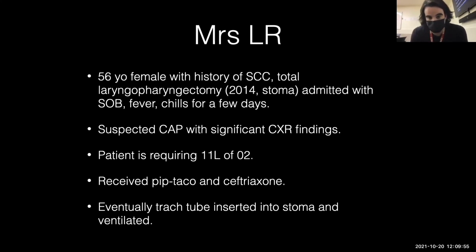This is a 56-year-old female, history of squamous cell carcinoma and a total laryngopharyngectomy, has a stoma. She was admitted with fever, chills, and she was transferred from up north, expected to be community-acquired pneumonia with fairly substantial Xray findings, which I'll show you shortly. She was requiring 11 liters of oxygen. She's receiving pip-tazo. You'll notice it says pip-taco. I just thought that was funny, so I just left that there. And ceftriaxone. And eventually a trach tube was inserted, and she was put on the ventilator through her stoma.